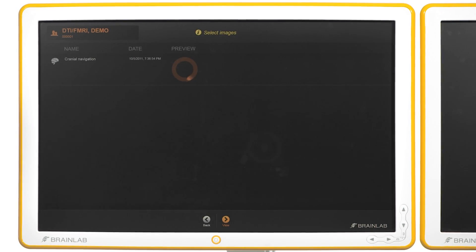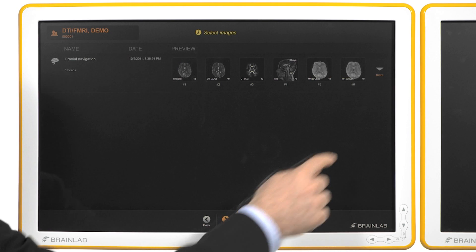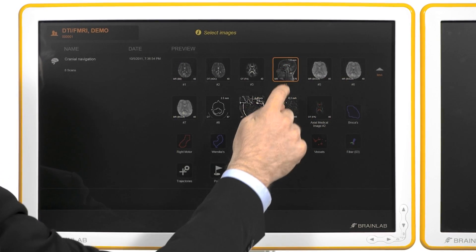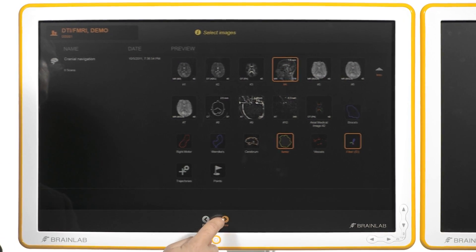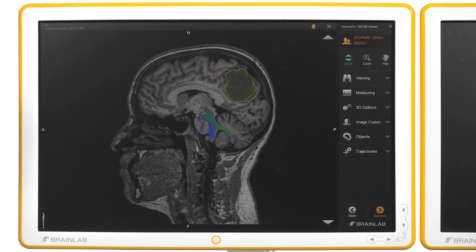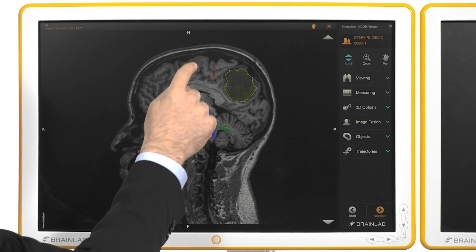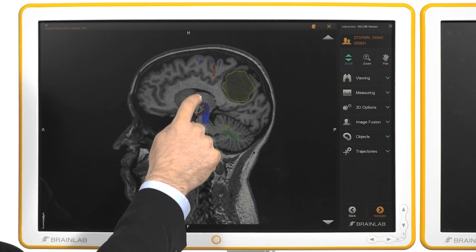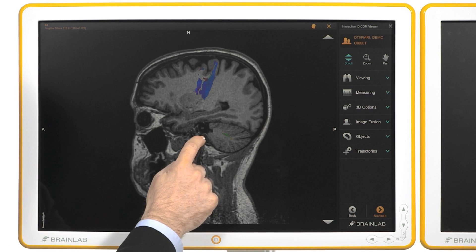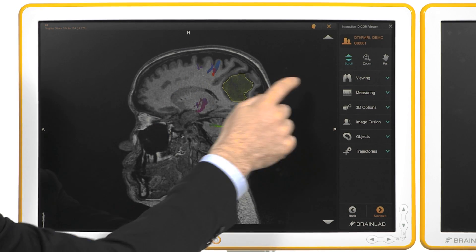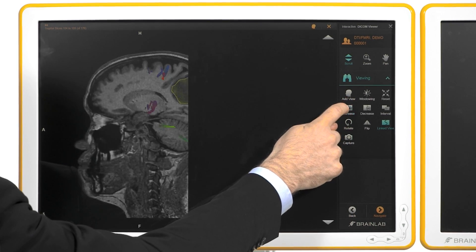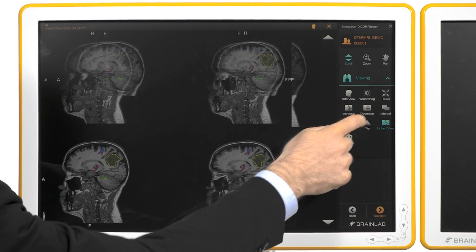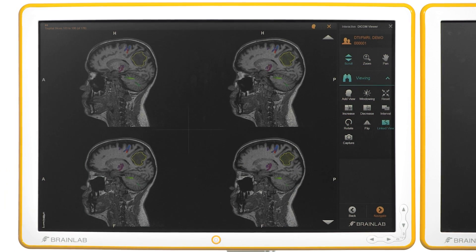In this case I will opt for one anatomical data set as well as a tumor and a previously created fiber tract. Within the DICOM viewer I can scroll easily through the data set and increase or decrease the number of slices for this specific view.